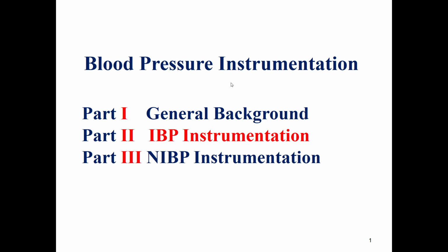Then we moved to talk about commercial applications of blood pressure readings in vital signs and patient monitors. Also, we talked about the non-invasive blood pressure module, and it's made up of a rolling pump, two pressure sensors, and two solenoid valves. Then we talked about the non-invasive blood pressure accessories such as the connectors and non-invasive blood pressure cuffs.